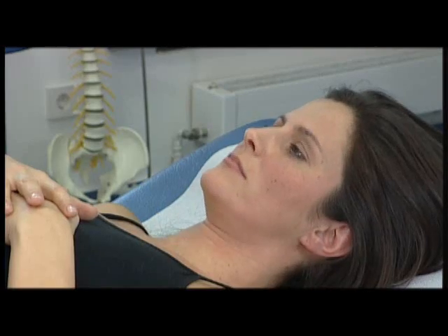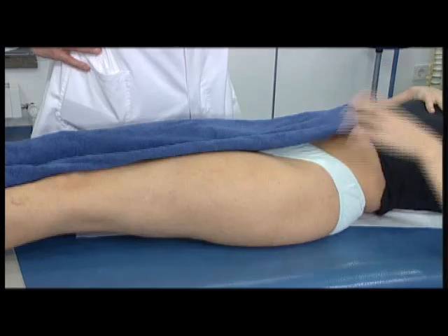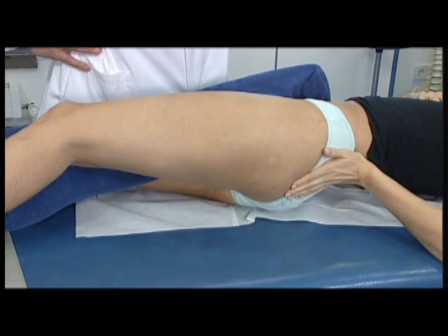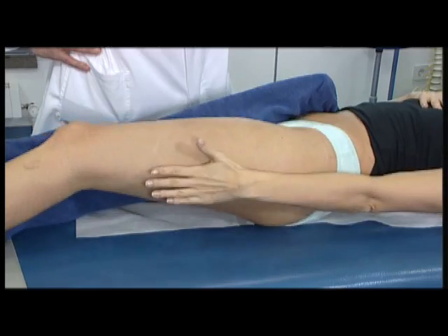Frau Schmidt, beschreiben Sie noch mal, wo Sie den Hauptschmerz spüren. The doctor asks the patient to describe the painful spots, which may even cause referred pain in the knee. Und dann auch hier im Gesäß und zieht runter bis ins Bein.